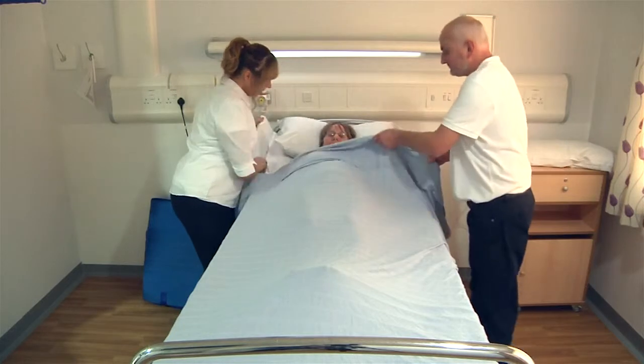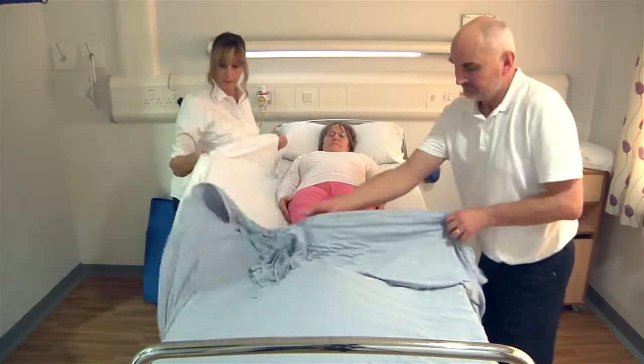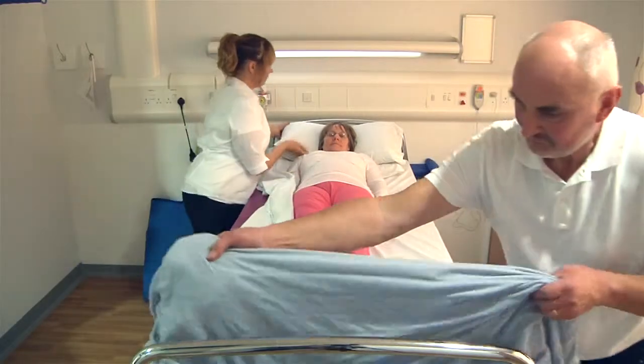If possible, open any doors in readiness for the escape. If time allows, always work with the bed at a comfortable working height.